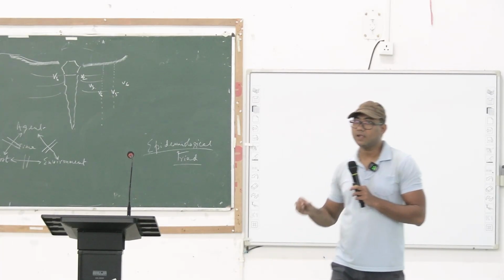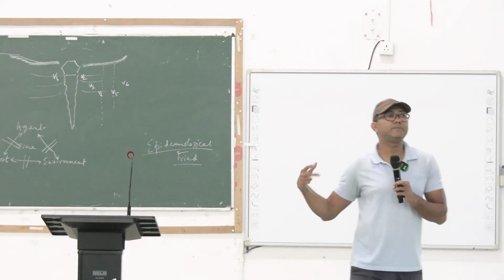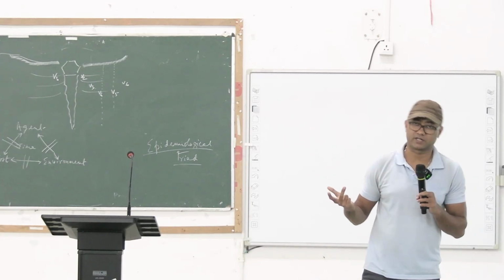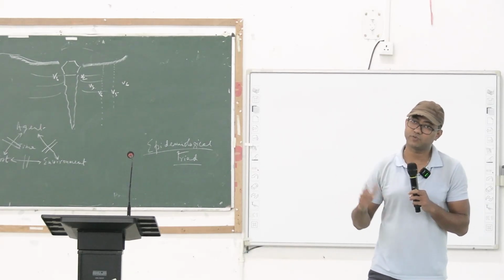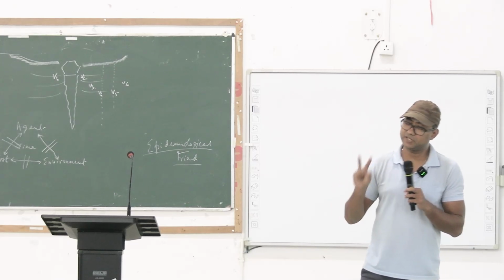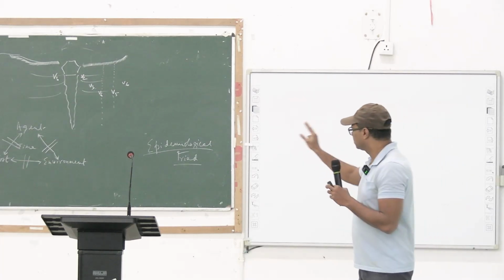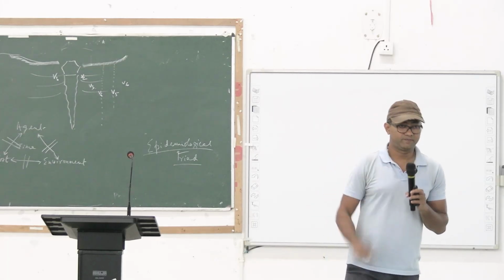So, we are calling these chest leads unipolar leads, but this term unipolar lead is a misnomer. A lead cannot be unipolar, it always measures potential difference between 2 points. To satisfy the definition of a lead, a lead must be bipolar. There is nothing called a unipolar lead, but conventionally the chest leads V1 to V6 are called unipolar leads.